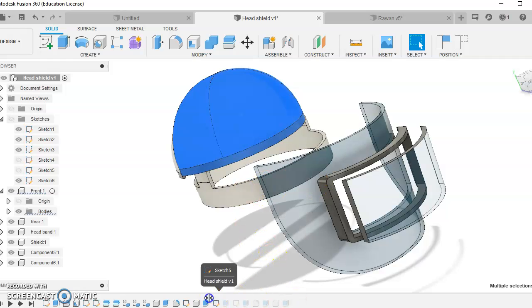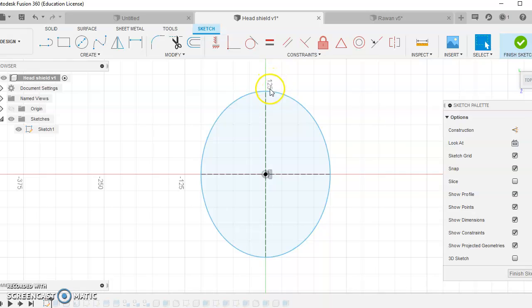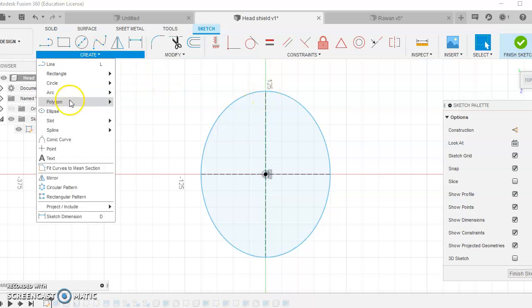Okay, so if we go back to the start of the development tree, which is here, the first thing you have to do is look at the sketch. I'm going to click on Edit Sketch just quickly. I'm not going to change the sketch, but if you look at it, you can see that it's 250 millimeters long. It's an ellipse. So I've created an ellipse from this drop-down menu, and the ellipse is 250 by 200. So you can see the dimensions there. And what I did, I got the measurements of the 60th percentile and put that in.